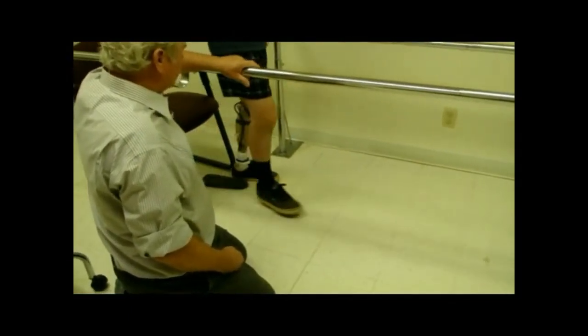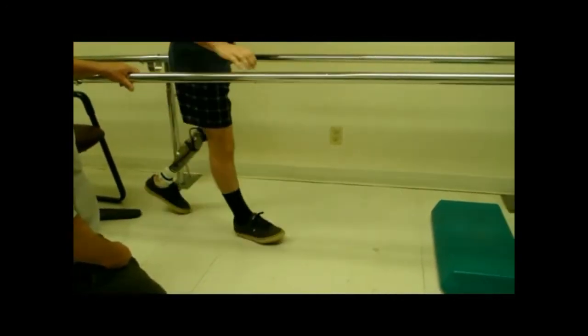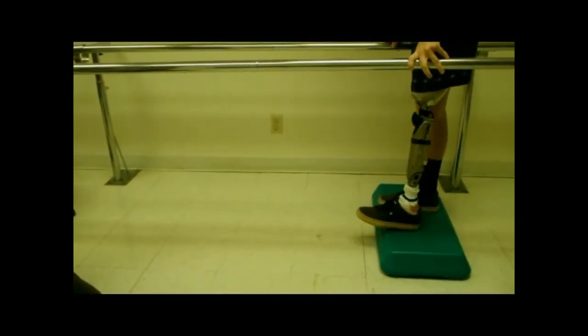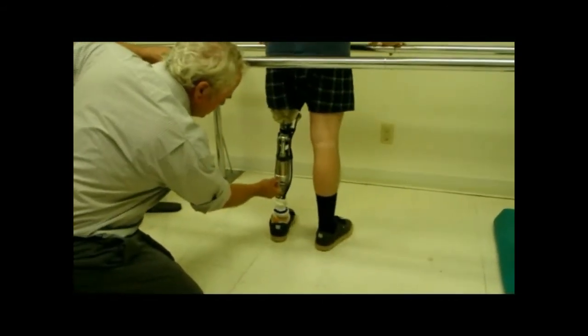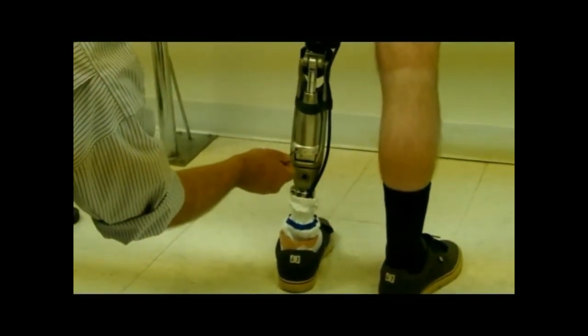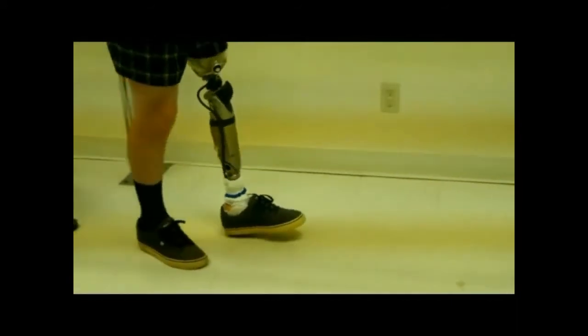There we go. Does that feel a little faster now? Yes. Okay. Good. Let's try the step. Still a little slow. I'm going to back it off a little more. Okay. Backwards first. There we go. All right. Good.